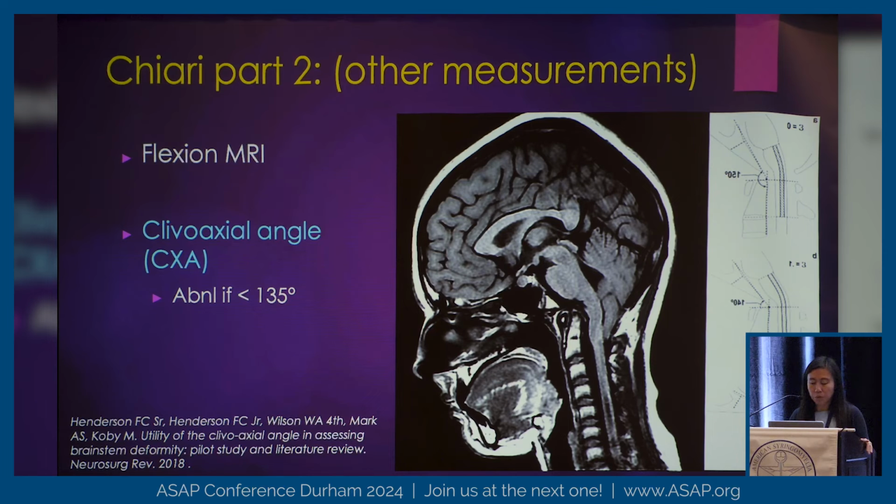So assessments have been made. Traditionally, these were done, I guess, at some point in flexion and extension on an upright MRI. There was a fad, you may have remembered, when upright was something that people were very into. I think that's died down. I haven't heard as much about it. I think they still do exist, but they're not as popular now. So nowadays we just do these in a normal MRI lying down, but we bump the patient's head up with a blanket or some foam device we have so that they are flexed in the scanner. So we would do them in neutral and in flexion.